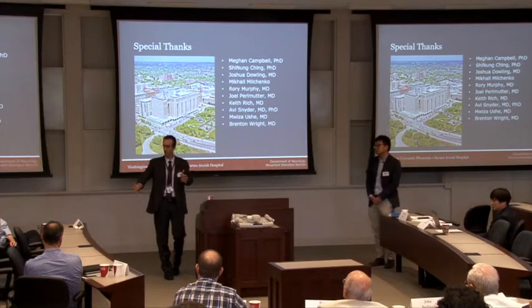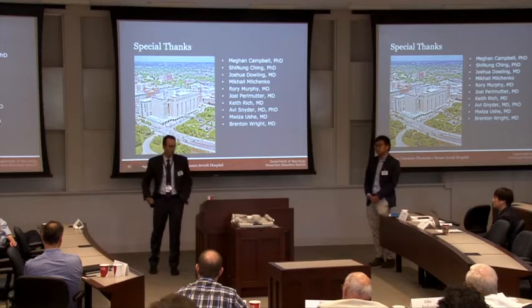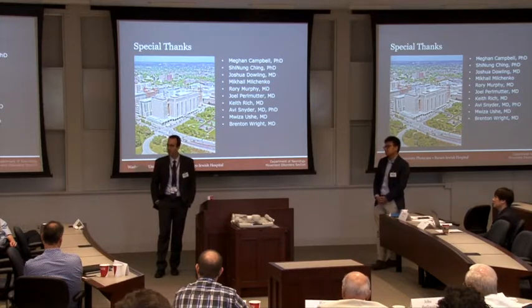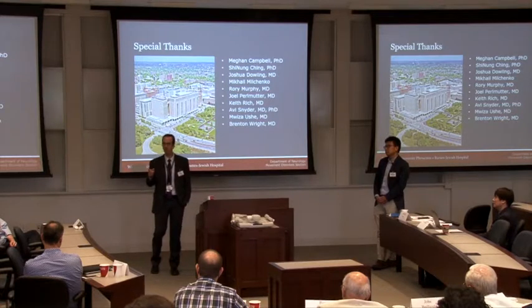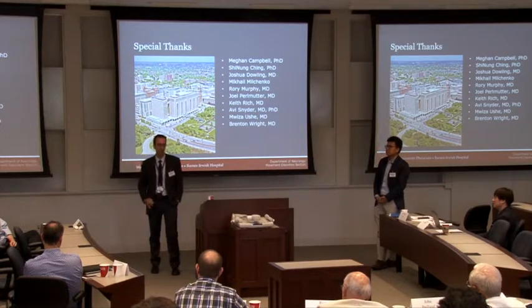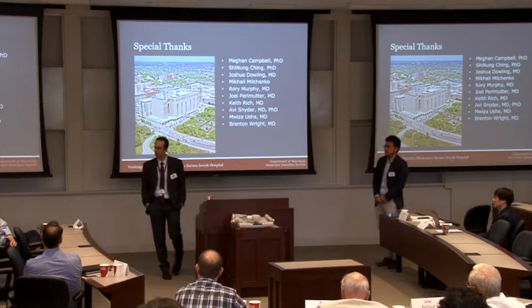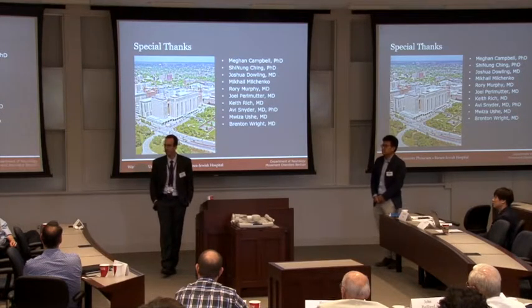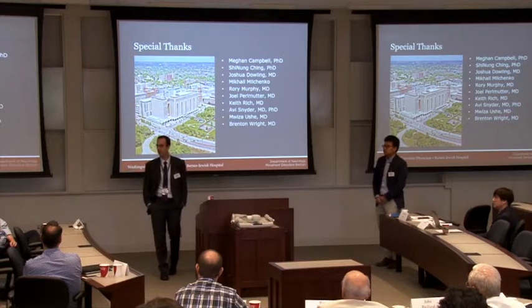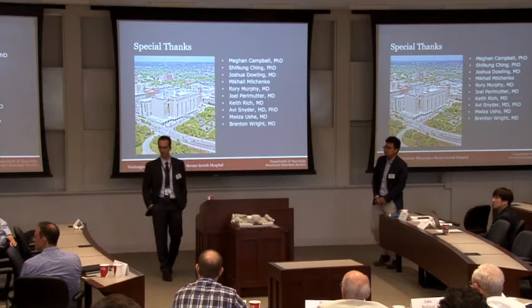Thinking about dystonia, these are the abnormal postures that cause a lot of disabling features. Dystonia is very challenging to program from a DBS perspective because the effects of stimulation are much delayed, often on the order of weeks to months after we make adjustments. And so, what's causing that? Likely neuroplasticity. At what level? We don't fully understand that. And so that's a mechanistic component that's very important in thinking about these circuits. Did that help clarify some things and answer the questions?